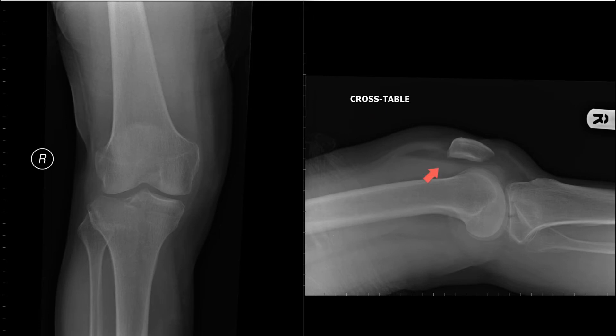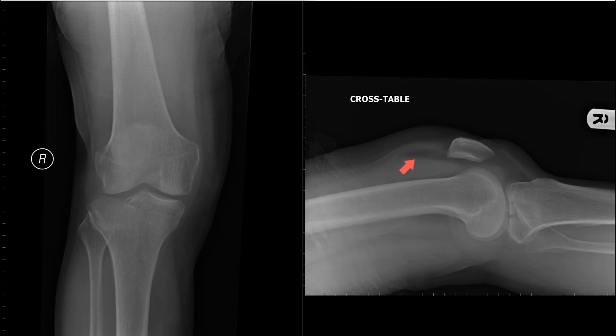Blood enters the joint from the fracture, which is intra-articular. The bone marrow also contains fat globules, which are released into the joint and float on top of the layer of blood. And this is the basis of what you're seeing on the x-ray in a lipohemarthrosis.